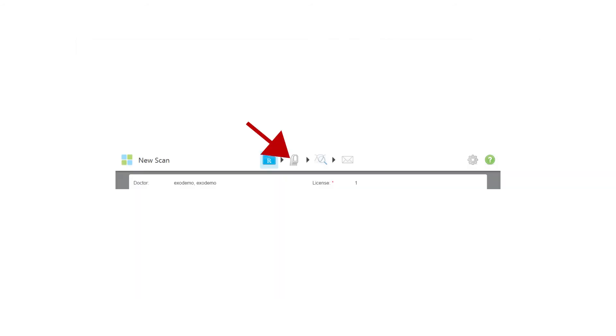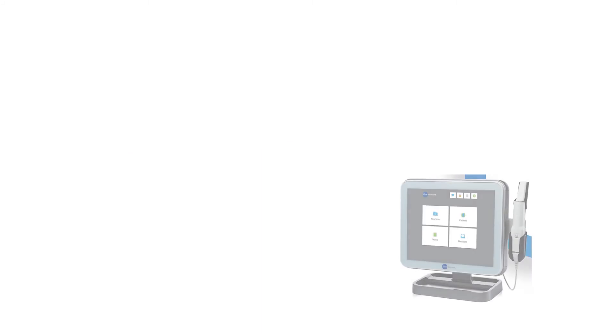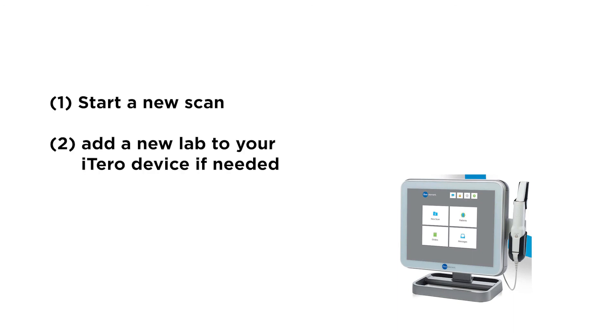When you are ready to complete your scan, select the scan icon from the top of the screen to engage the scanning wand. To recap, you can now start a new scan, add a new lab, and begin scanning.